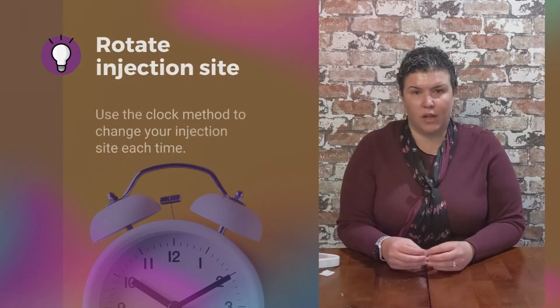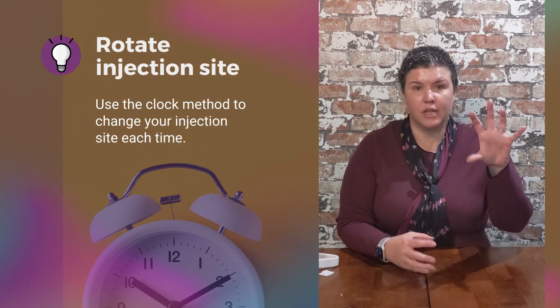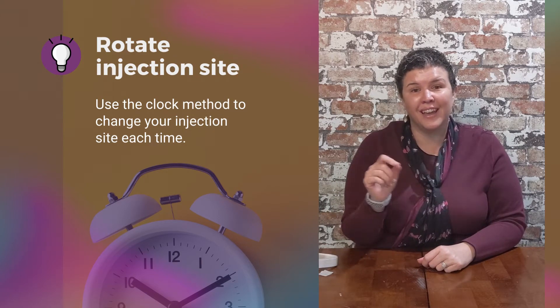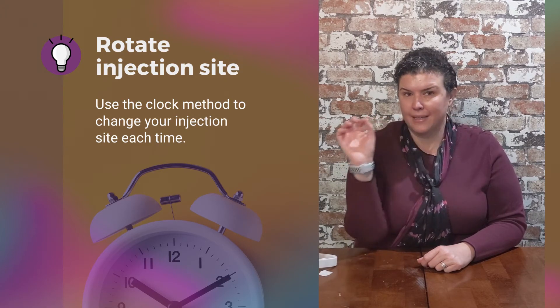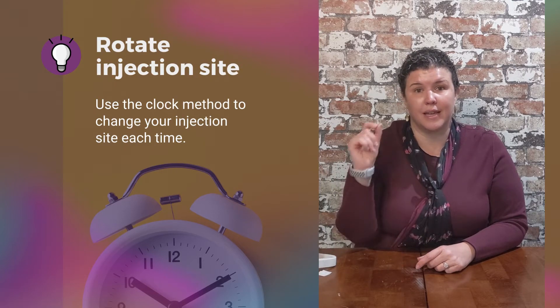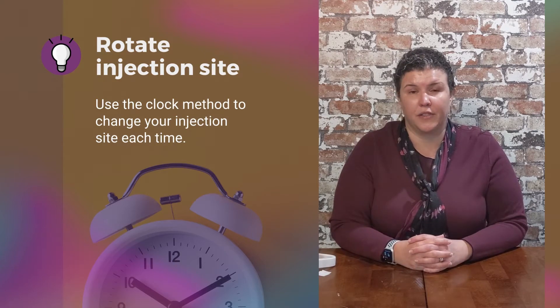You always want to rotate your injection sites. Think of each side of your abdomen as a clock. After each injection, whether day to day or week to week, you go from side to side. When you go back to that side, you pick a different number on the clock. This ensures that you never inject at the same point every single time and create scar tissue underneath that injection site.